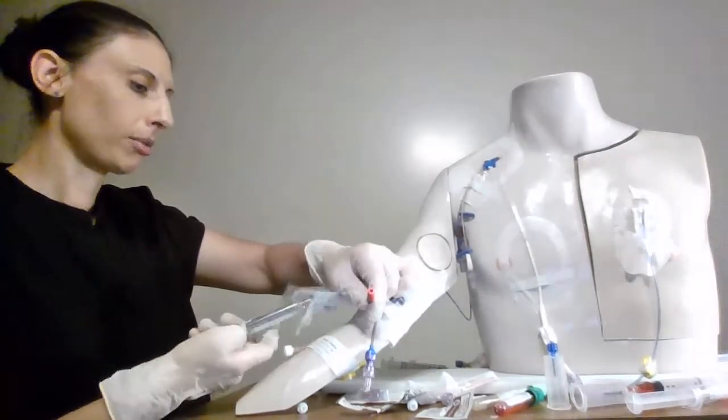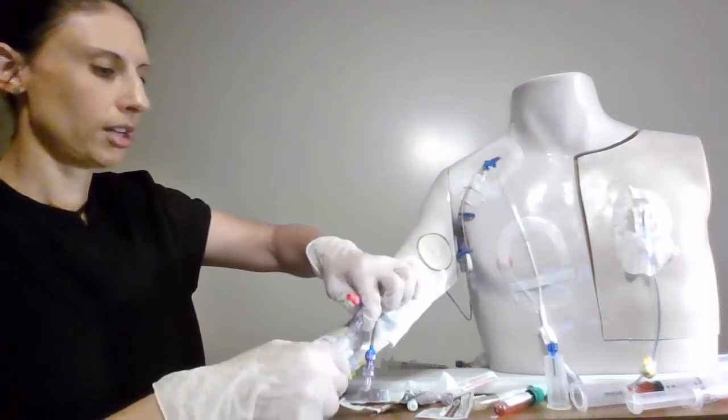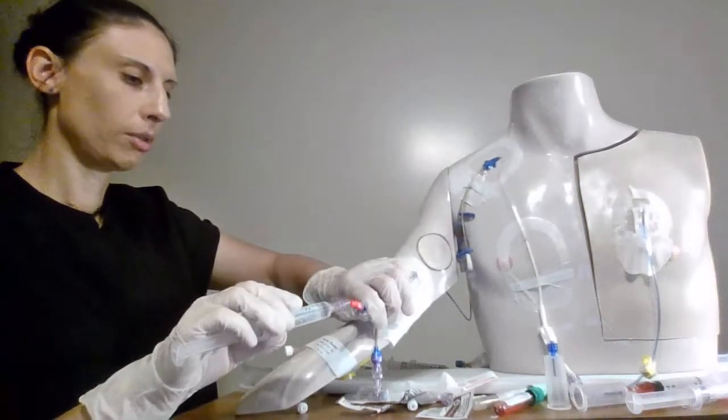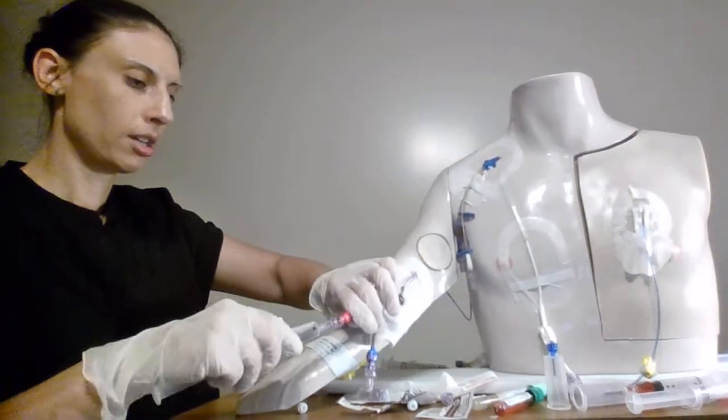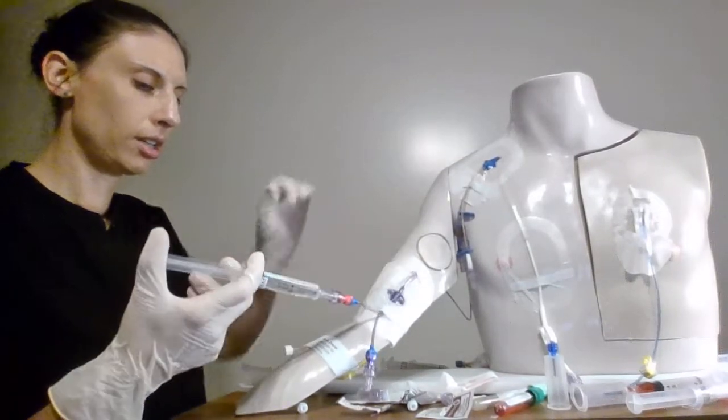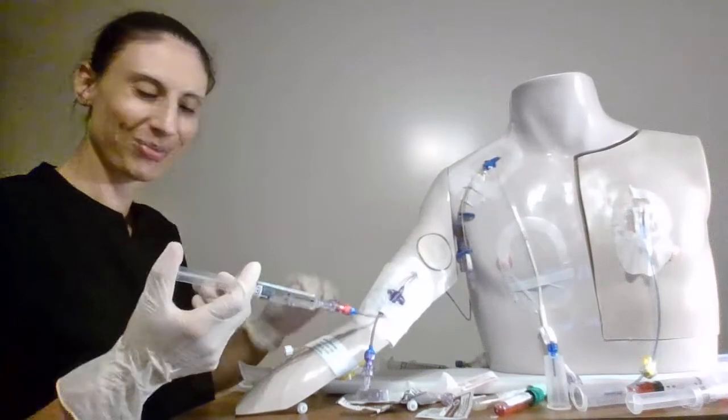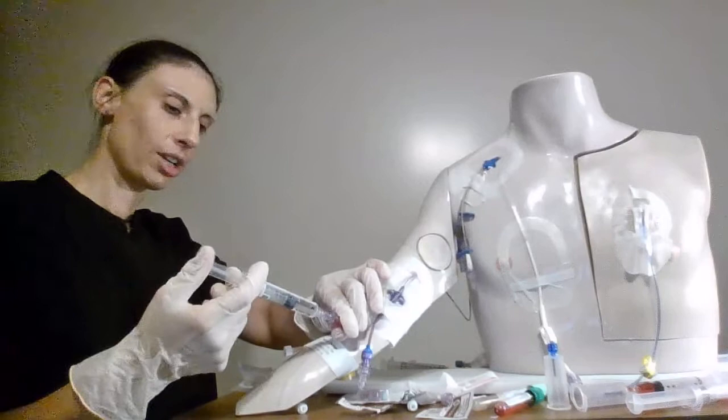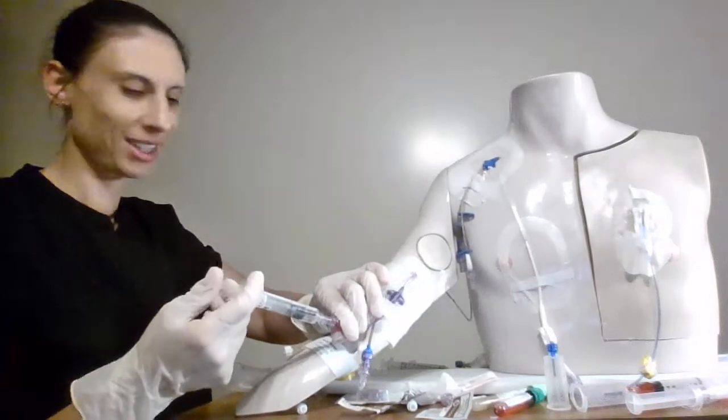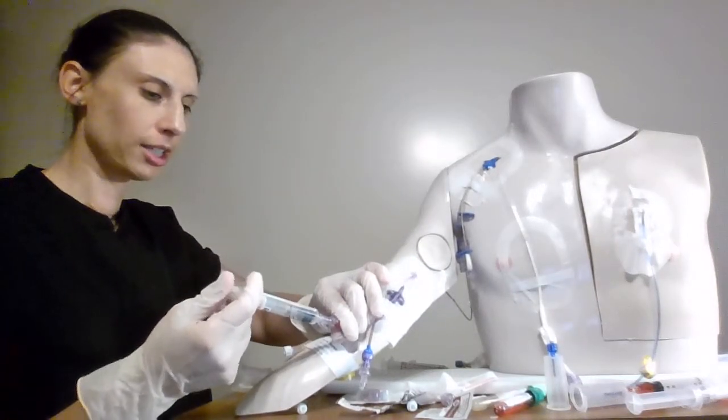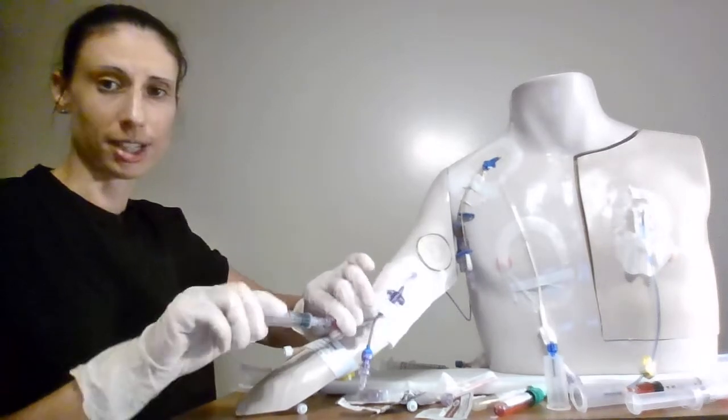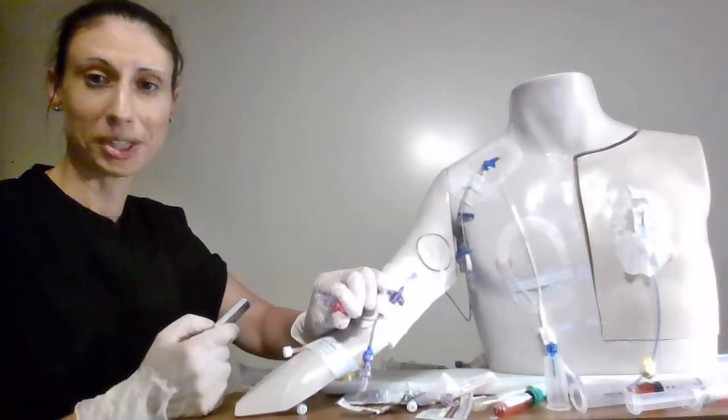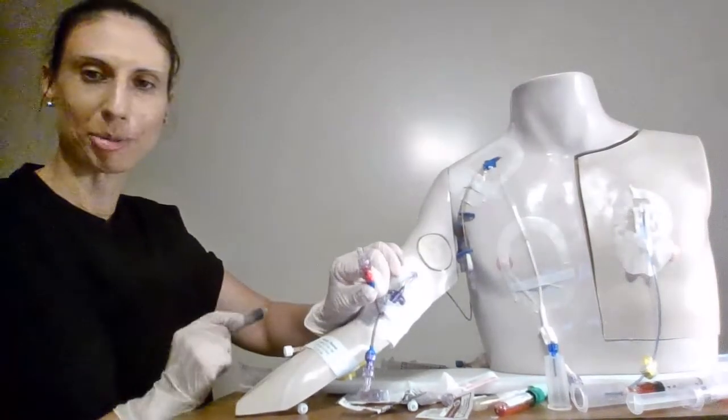We've got our cap ready to go. We're just going to take off that blue end. And we're going to attach that. And then we're going to flush. And we can use our push pause push pause one ml each time just to create some turbulent flow just to make sure that lumen is nice and clear. And that locks it. We only need 10 cc's because we didn't draw any blood. So it was just a normal saline lock flush with our cap change.